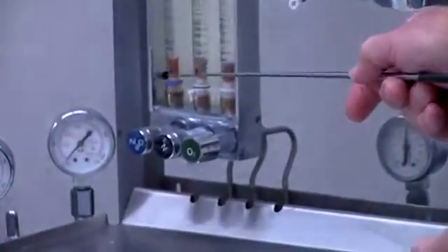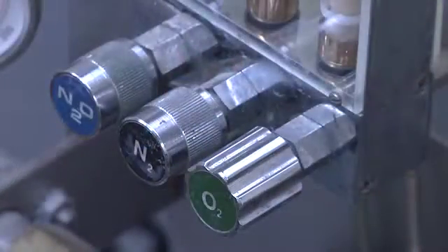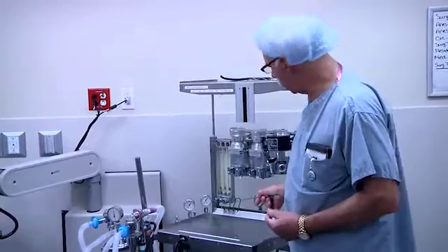Starting at the flow meters, we can see there's nitrous oxide, nitrogen, and oxygen. The oxygen knob does have the fluted feel to it that came about a number of years ago. Air was not available at the time, so they used nitrogen and made air with a combination of oxygen and nitrogen.